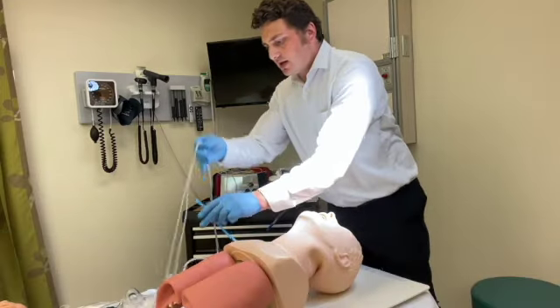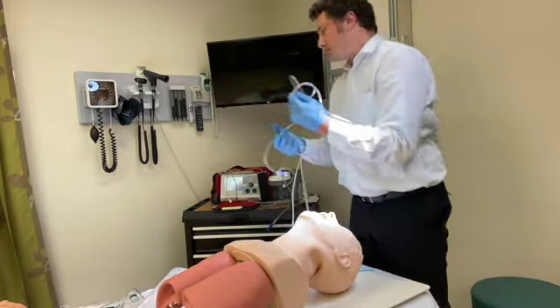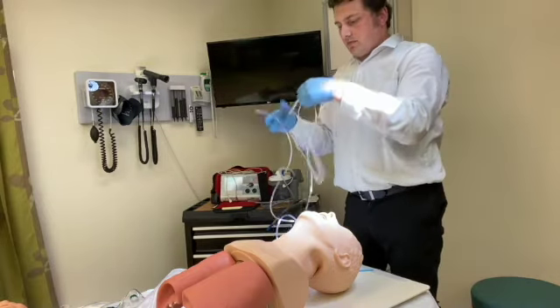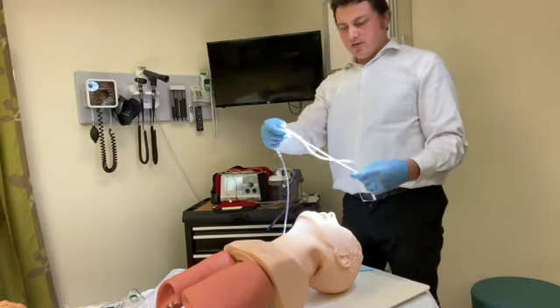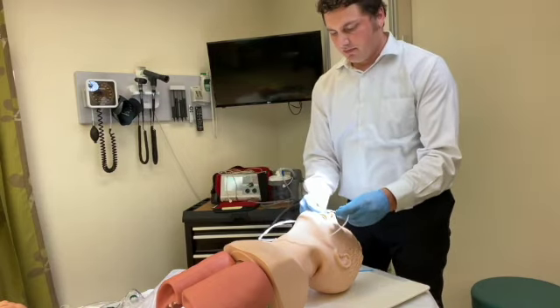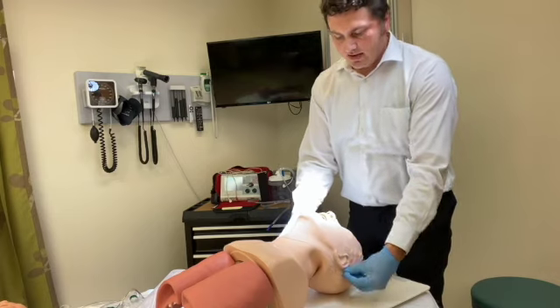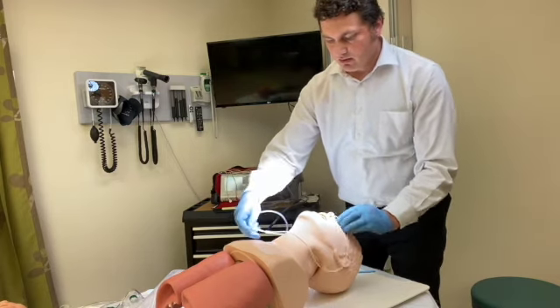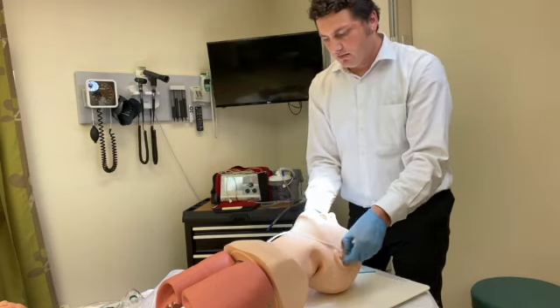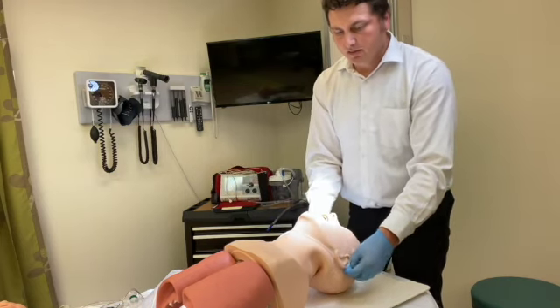So first we're going to talk about some basics, and the most basic includes your nasal cannula. You'll identify the actual nasal cannula, and you'll hook it up to oxygen, which your tree will be up in the back, and you'll want to place it over their ears and into their nose. It'll be at the front of their body, like so. And then just tighten it up right underneath their neck. Okay. So that's your nasal cannula placement.